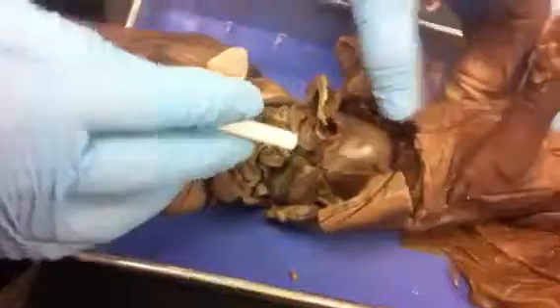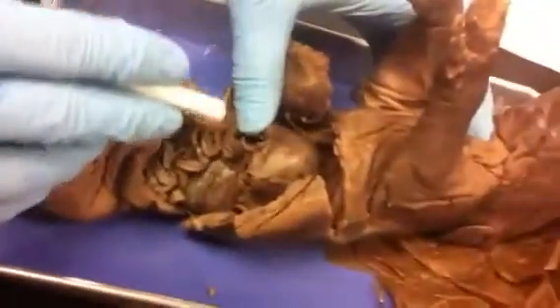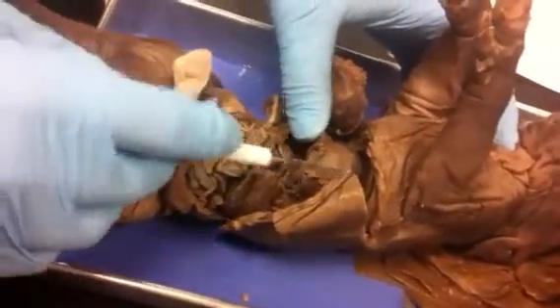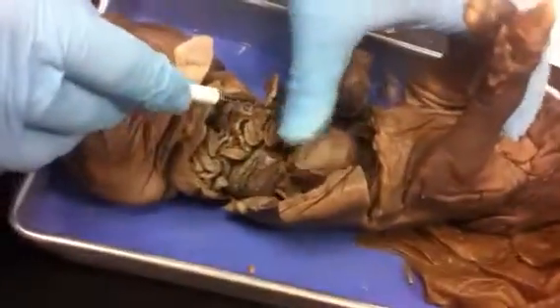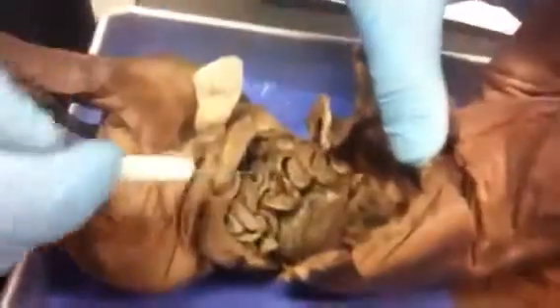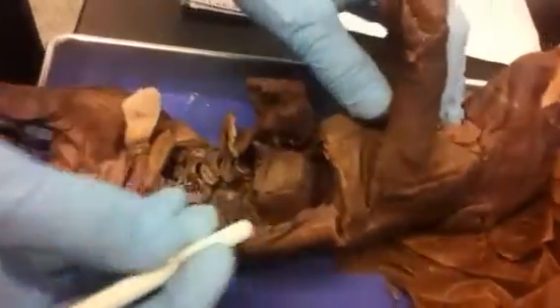The liver has four lobes — the lobes are right here. The gallbladder is right under it. And then the esophagus is behind it; you can't see it.